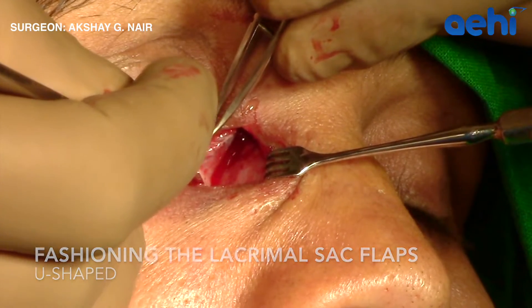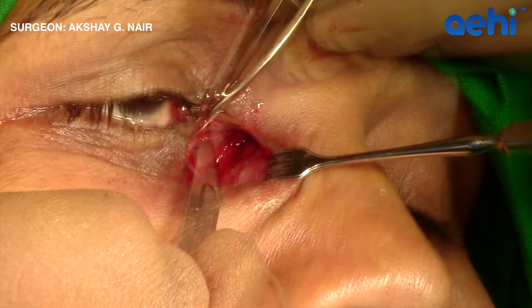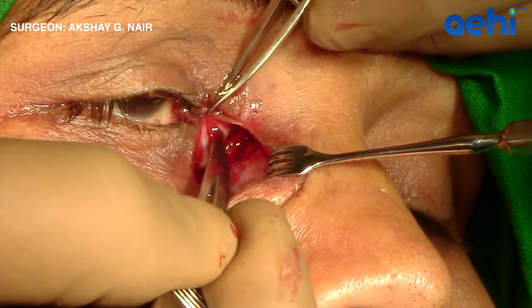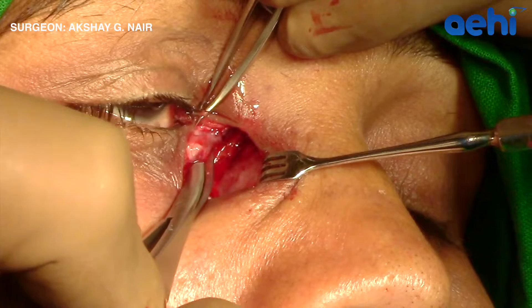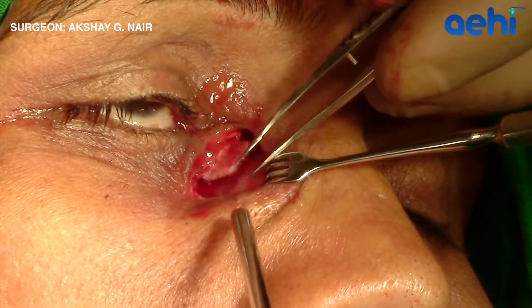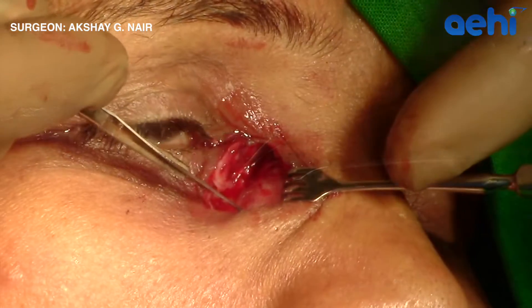A vertical incision is made inferiorly on the lacrimal sac, and superiorly a similar incision is made. Following that, using a pair of scissors, the two incisions are joined to create a large lacrimal sac flap. One can check the adequacy of the flaps and the ostium by introducing a probe through the puncta.